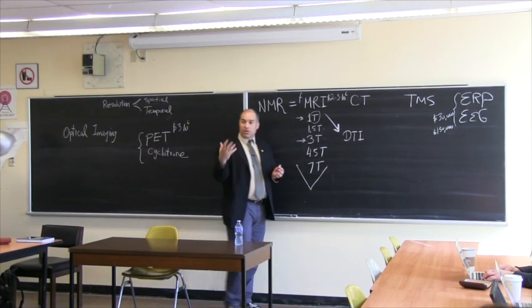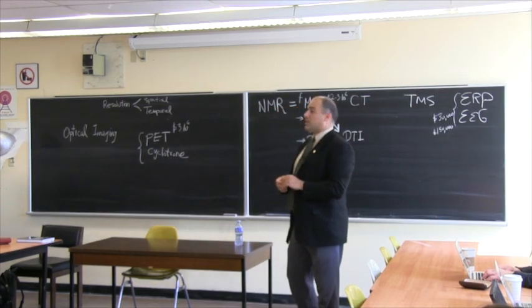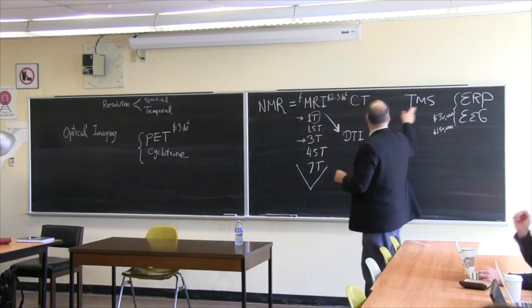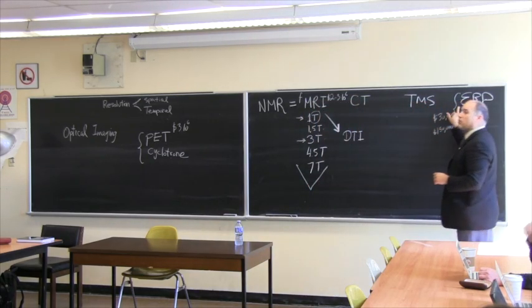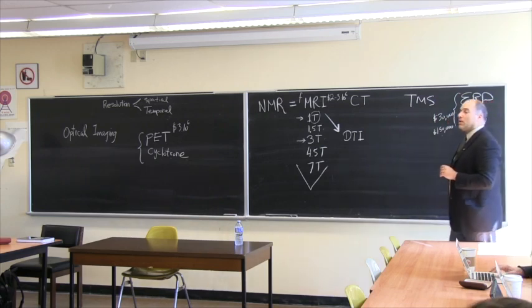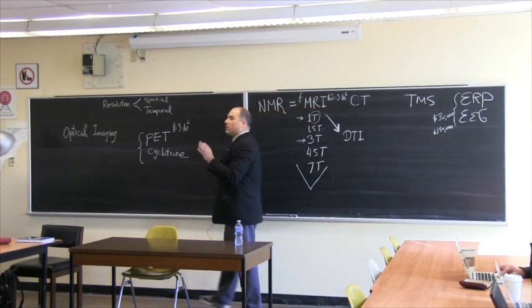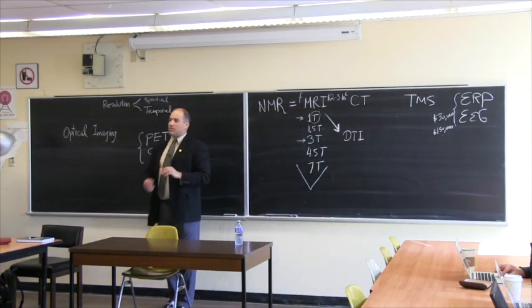The other thing is to perform these measurements concurrently. And for that, we have developed fiber optic ERPs. Everything in the system is actually not magnetizable, from the electrode through the cable, through everything. These things cost a fortune, forget these numbers. And then you can actually perform ERPs together with MRI simultaneously. There are all kinds of technical difficulties, but it's doable.